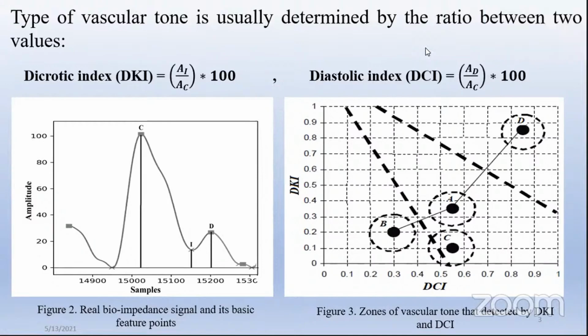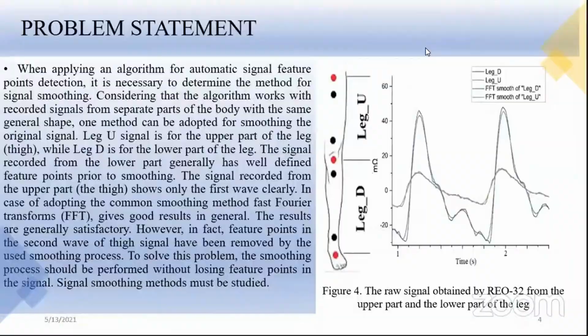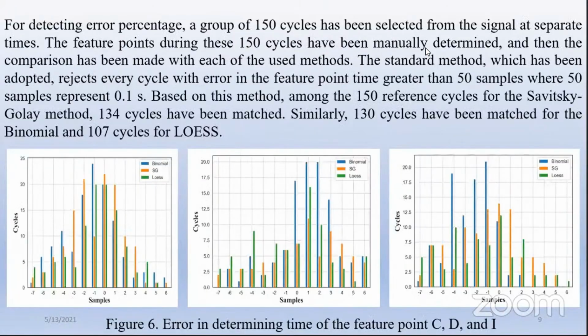As a basis, I use Python, and in SciPy, yes, there is Savitsky-Golay as standard, and I wrote the binomial method. Our objective purpose of the study is how I can compare those results by using the smoothing methods in SciPy, Python, and binomial. The purpose was to find the error percentage in time, and after that I chose binomial, but I tried smoothing methods in Python SciPy.